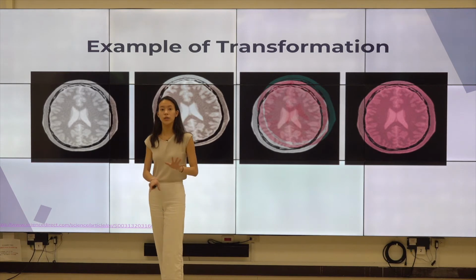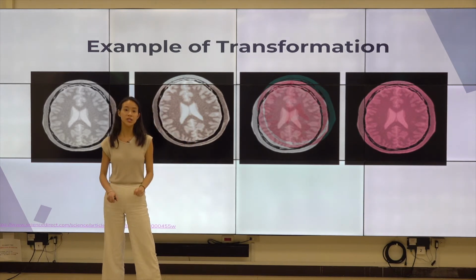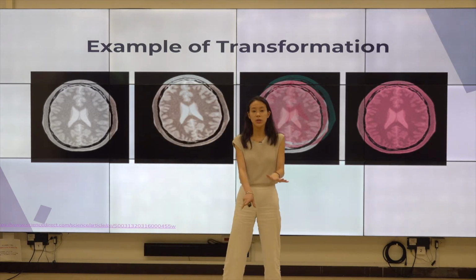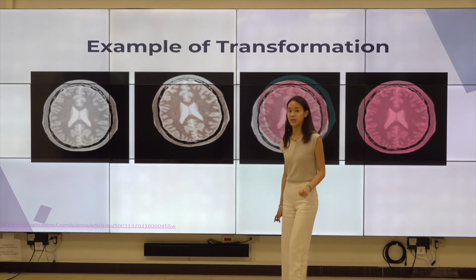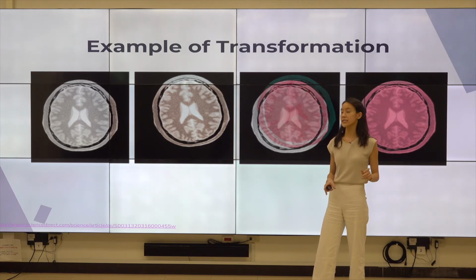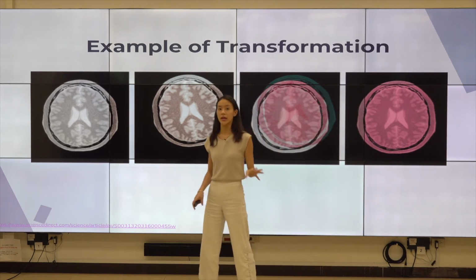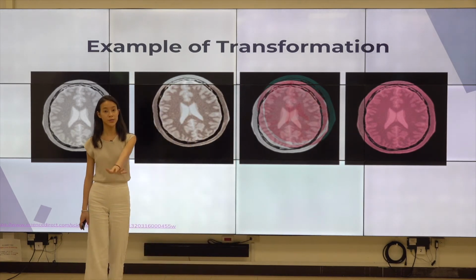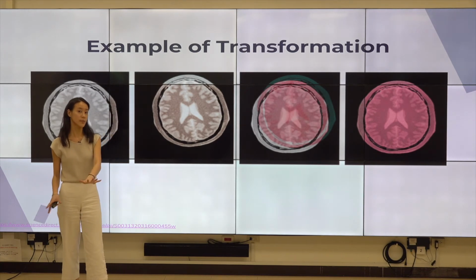And so what you would learn, I'm hoping, is that with each iteration or each try that you take, you get closer and closer to two hands exactly overlapping on top of each other. It's the exact same kind of situation when it comes to registration, when we're trying to register a moving image to the reference image. The bottom hand that we originally had would be our reference, and the top would be the moving.